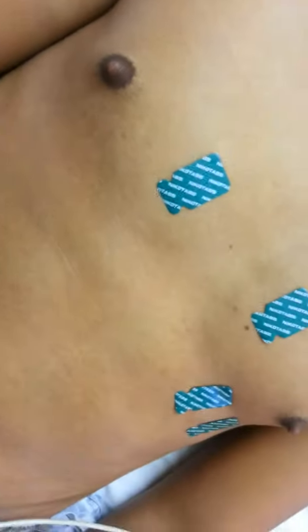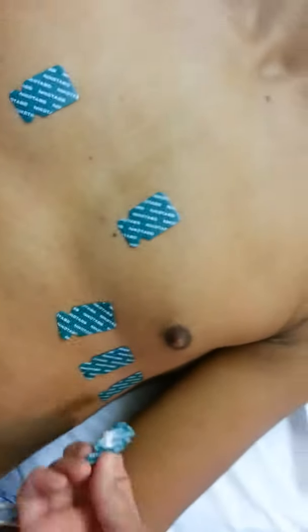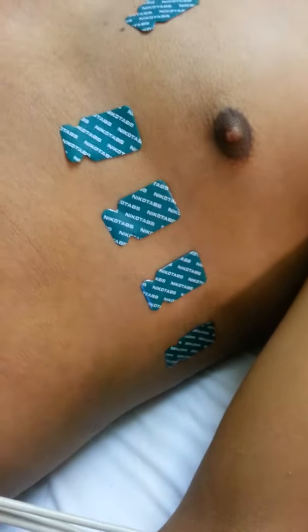You put number three over here, number five, number six — all the way across. Then the arm leads: one arm, another arm, then leg, leg — and that's it.